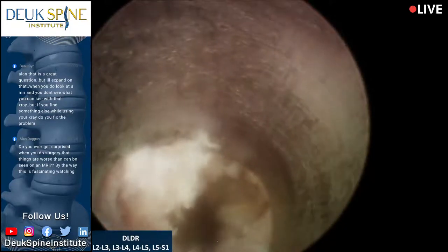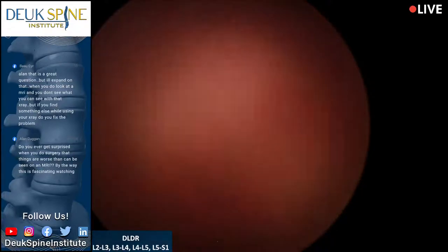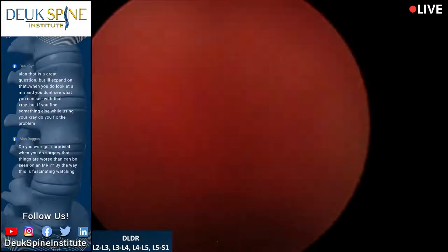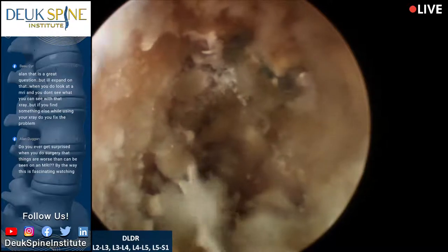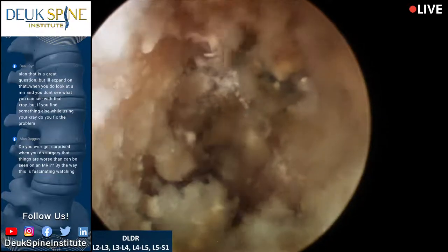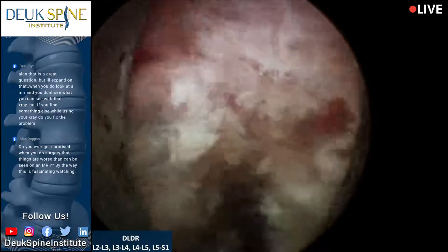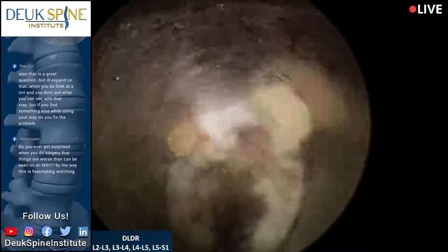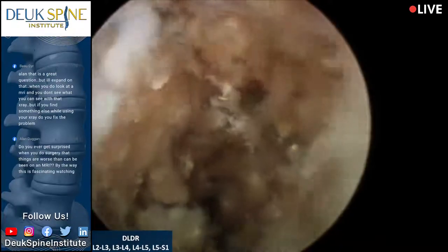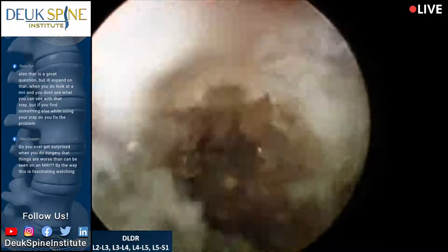All right, we're pretty much done with this disc. So what we're looking at here is the tear, and I've debrided it. And now, oh, let me have the grabber again. We're going to be able to see better if I put the grabber in there. All right, so somehow the grabber always stops the little bit of bleeding. Let's look for the nerve root. And there it is up there in that fat. And this is the back of the disc that's actually where the tear was and the herniation was, and it's gone. So there's just a little bit of arthritic stuff here.